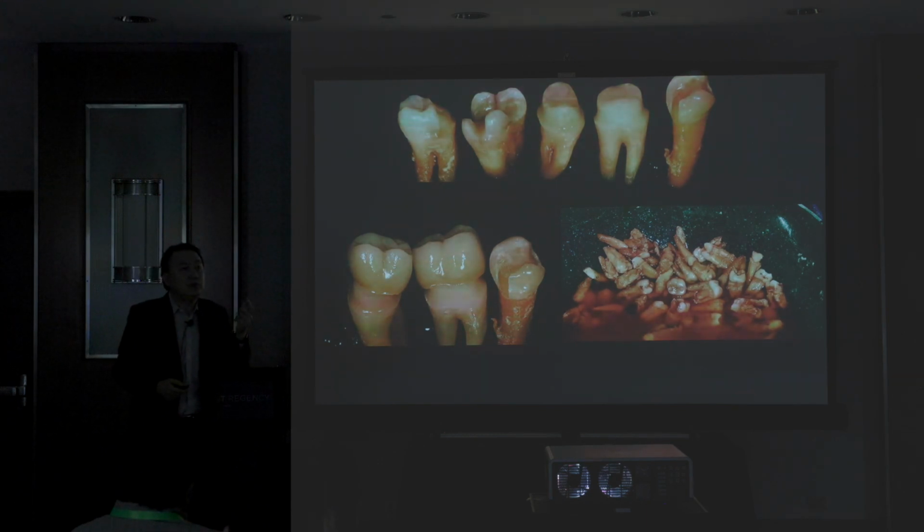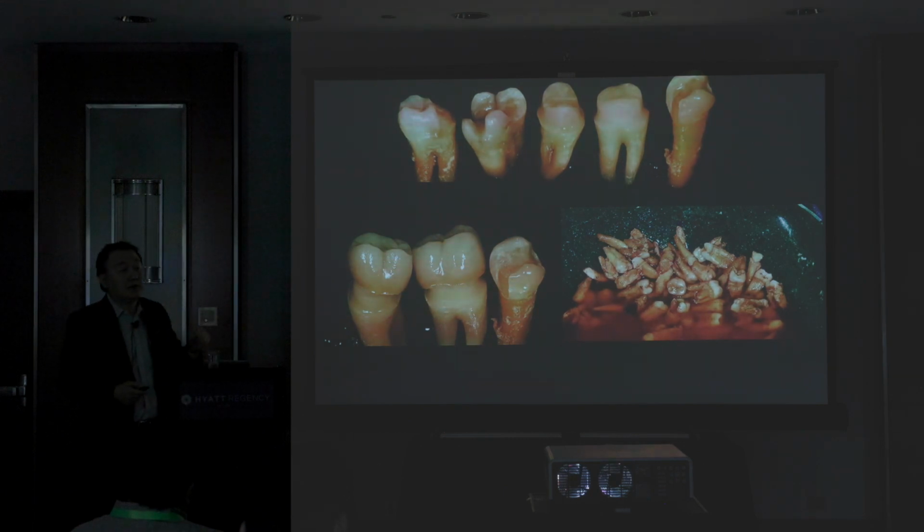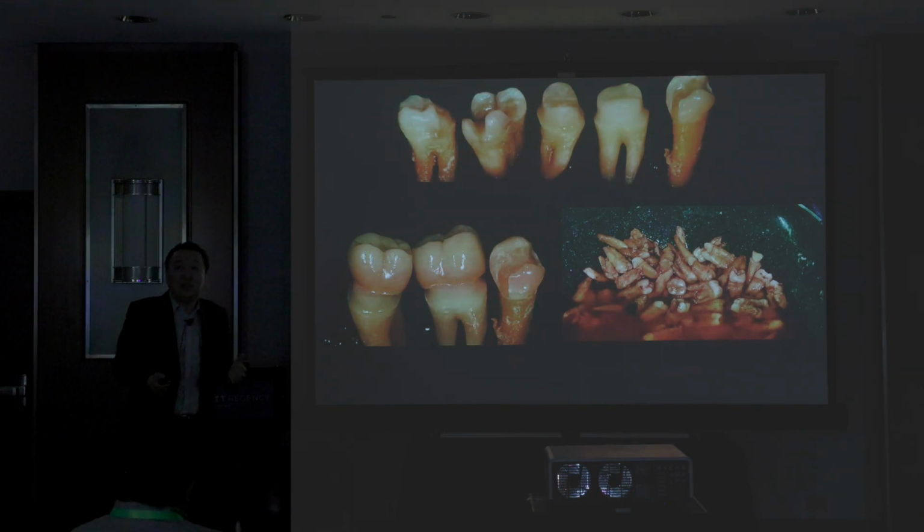how can you choose the color? For example, the doctor said A2. So you choose A2, right? So you made A2. You send it out to the doctor. Here's my question. What is the difference? You make A2. I made A2. It's all confusing. What I want to know is what color from the photo.